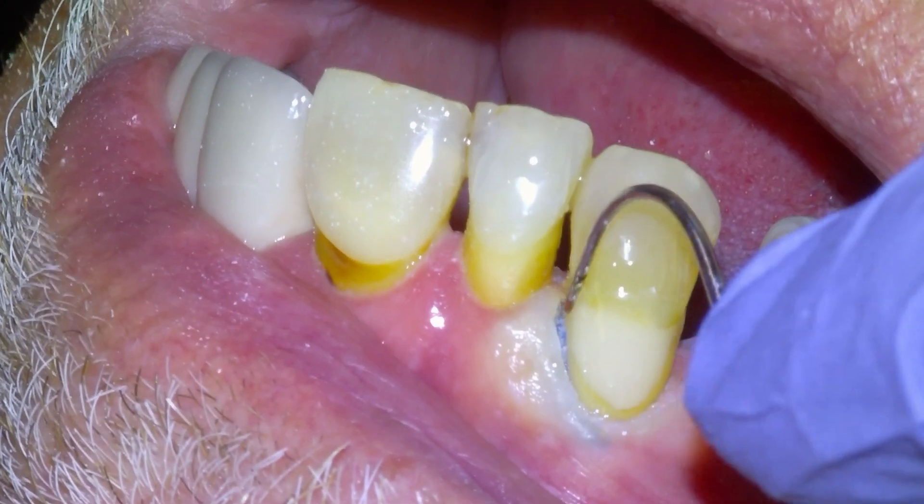Once we're back down on the natural tooth margin, we're going to rinse the filling, dry it off the surface, and then apply a coating agent — this is Equia Coat — and light cure that. That finishes the filling. We're going to get started with the root canal and remove the cord from the sulcus.